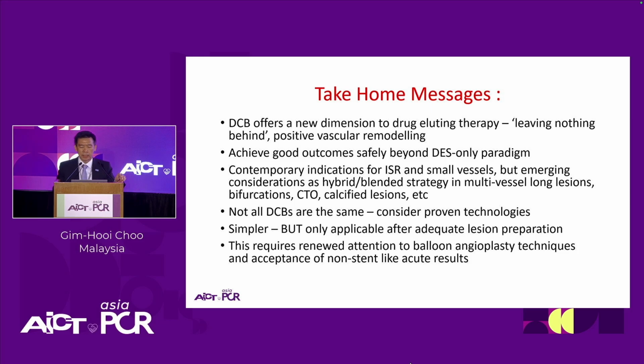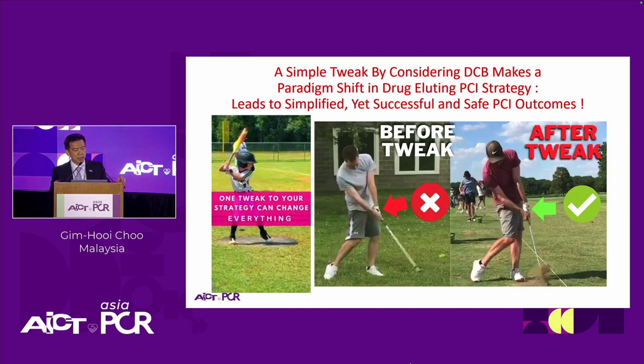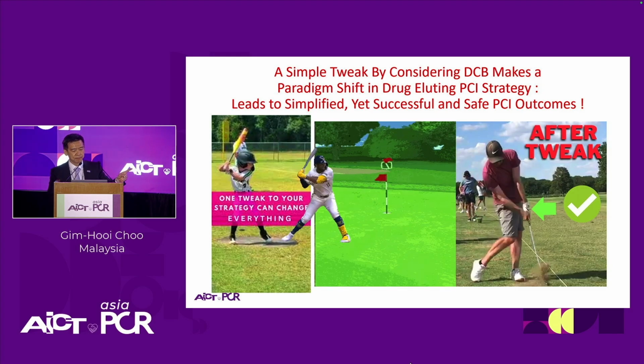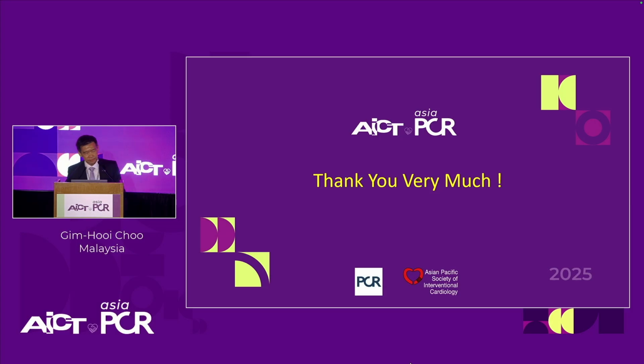You've got to consider using the proven technologies. It makes life much simpler, but it's only applicable after you have prepared the lesion well. We have to renew our attention to proper balloon angioplasty techniques, and we accept a bit of acute non-stent-like results. A simple trick to your strategy will be a big paradigm shift. Just tweak your golf swing, and you're going to get a hole in one. Thank you very much.